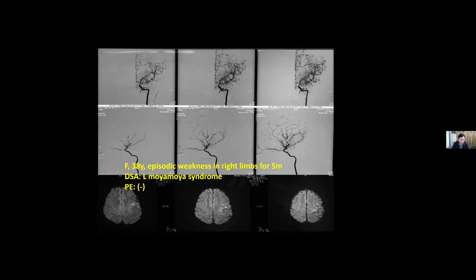This is my latest case — a female patient who suffered from episodic weakness in the right limbs for five months. You can see some small infarctions on the left hemisphere.